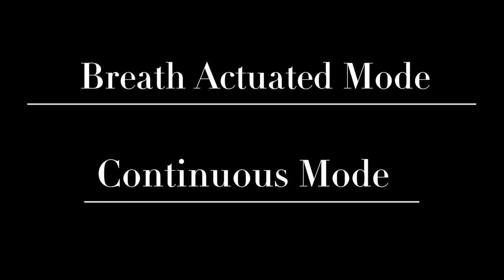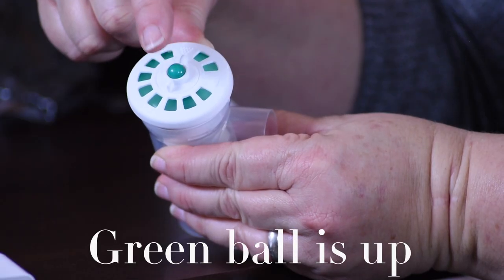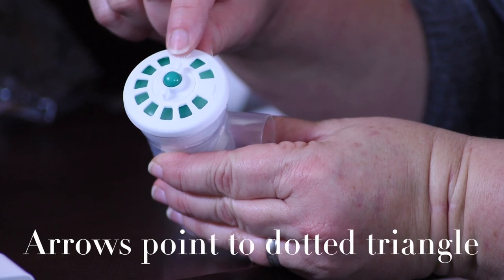Let's look more closely at the nebulizer cup. This particular model can deliver medication in one of two modes: breath actuated mode or continuous mode. We can tell if the device is in the breath actuated mode because the green ball on the top of the nebulizer cup is in the up position and the arrows are pointed toward the dotted triangle.